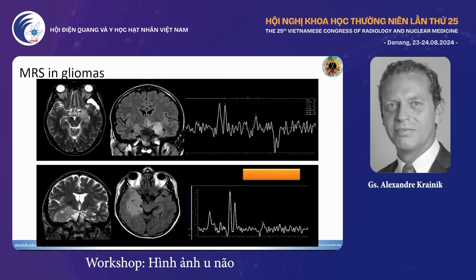Here it's quite an interesting slide because it shows you two temporal infiltrations. You see, they look very, very similar. We put contrast media. There is no contrast enhancement. Okay, and well, I don't give you the clinical context, but the image looks quite the same. The main difference was on spectroscopy. And you see here, for instance, you have a very low NAA with a high choline.